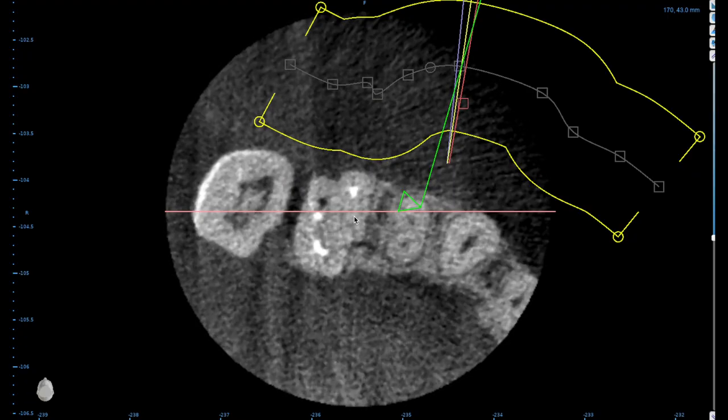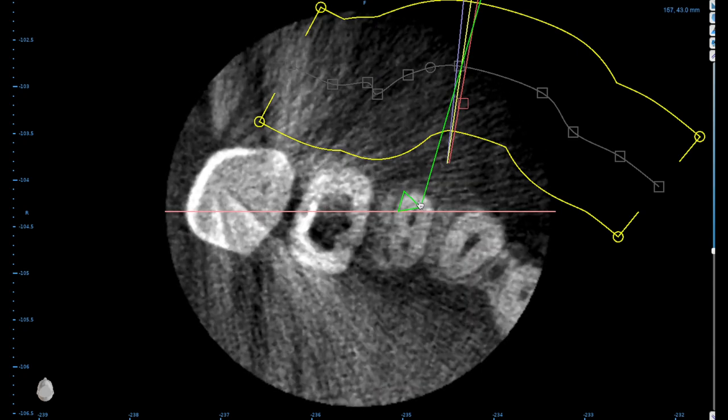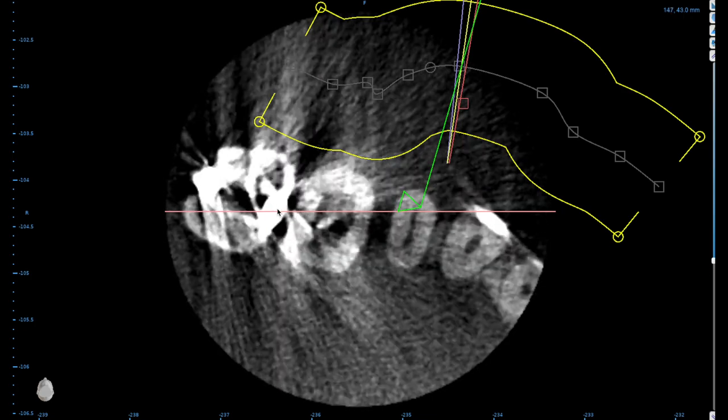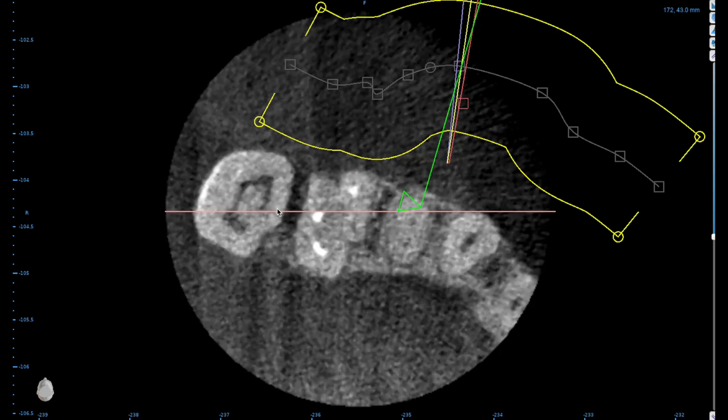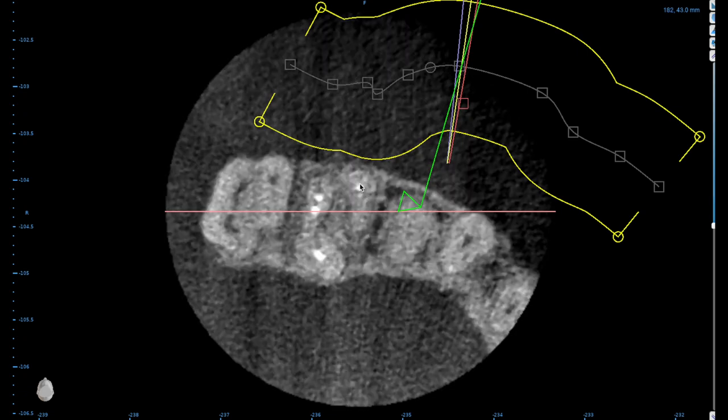This is our access. We're going into the access, we're at the pulpal floor. This is tooth number 15, 16, first molar, second molar. As we go up into the root, you can see these little white lines, this is where the calcium hydroxide is. Look at the shape of this root, the mesial buccal root. If we compare that shape alone to our distal buccal, there's our distal buccal root.